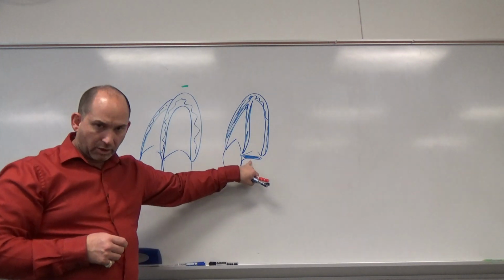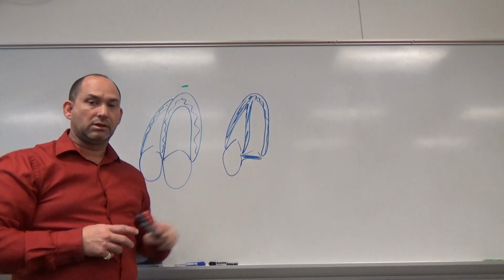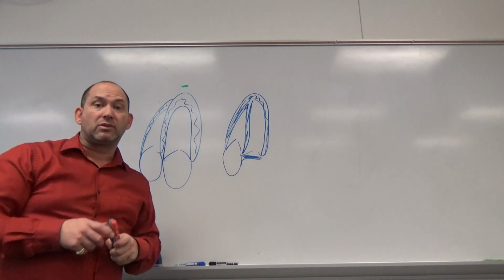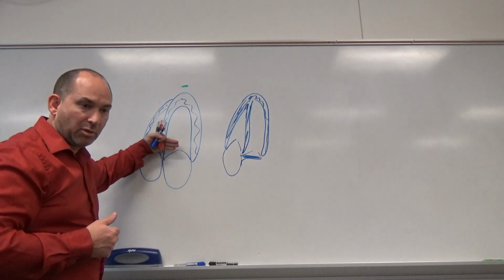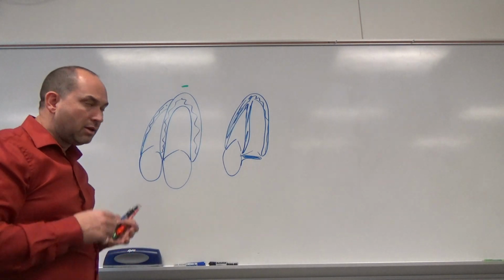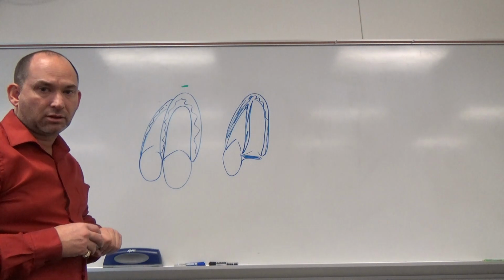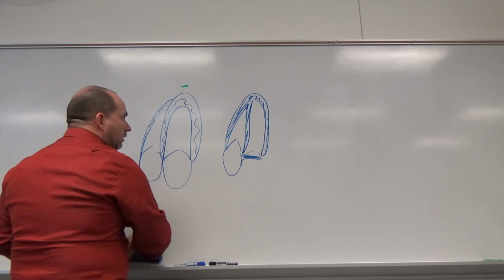Now, this is the coronary sinus. It runs along posteriorly behind the left atria, and this is a long axis view of that. In pediatrics, this is useful because you can take this view and tip it more posteriorly towards the spine and see the size and caliber of that, because that might indicate that there's an anomalous connection going on. Okay, so be aware of that.